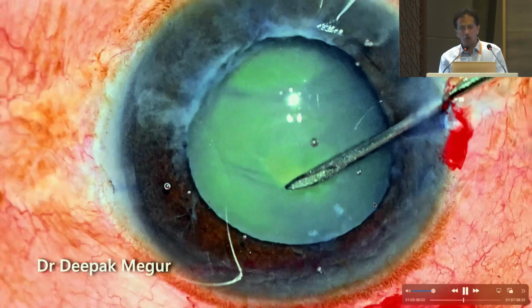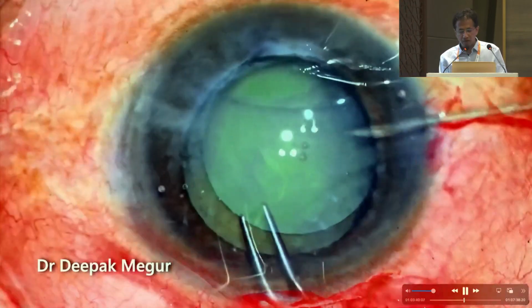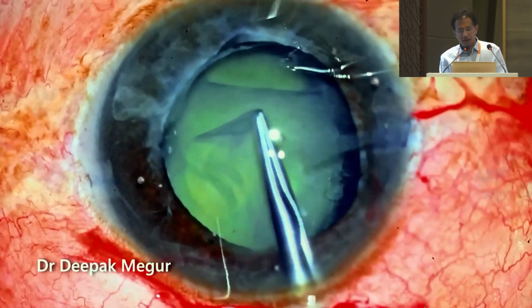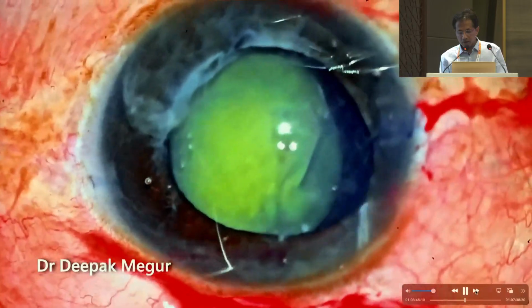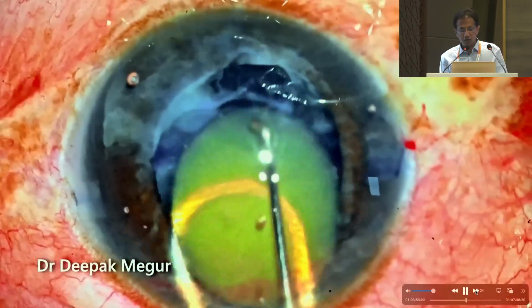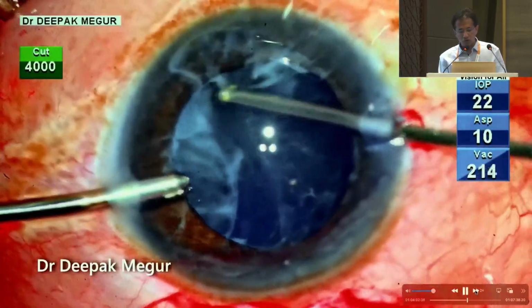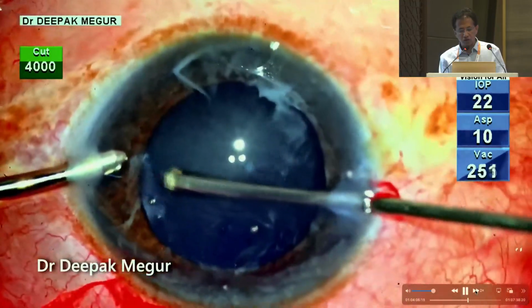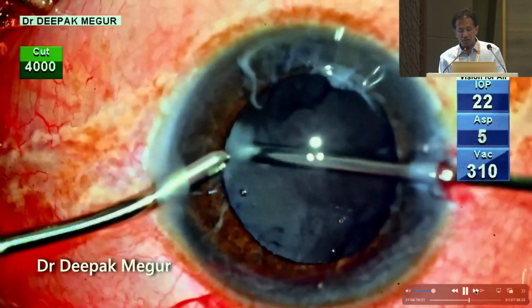Initially, my attempt was to try to save the bag. So I'm trying to puncture the anterior capsule and see whether I can save the bag by putting any ring or anything. But immediately I could realize that it was not going to stay there. So once the nucleus is expressed out, the bag is there, and some of the lens matter is also trickling down, the soft, liquefied cortex. So obviously there is no bag which can support this.